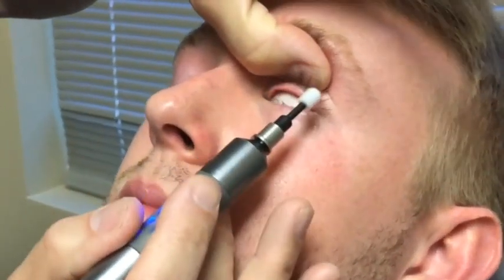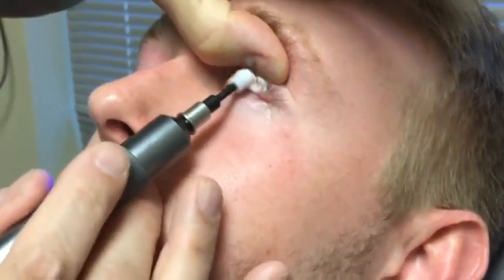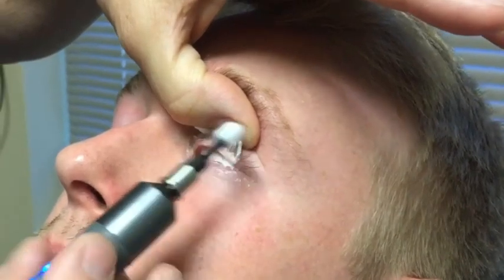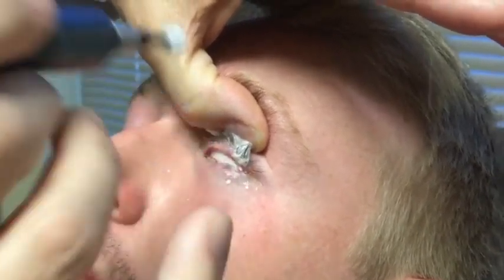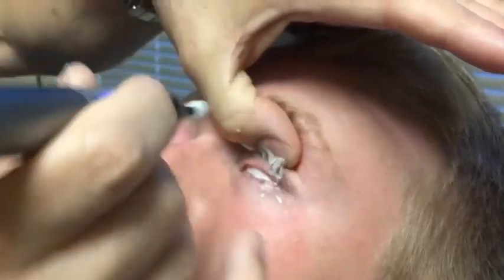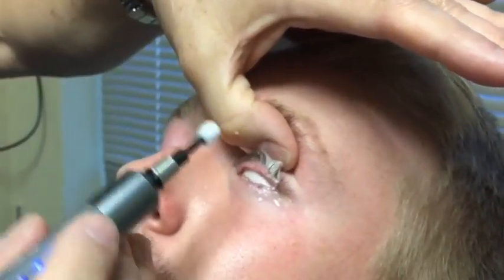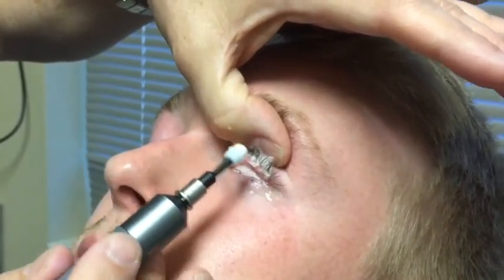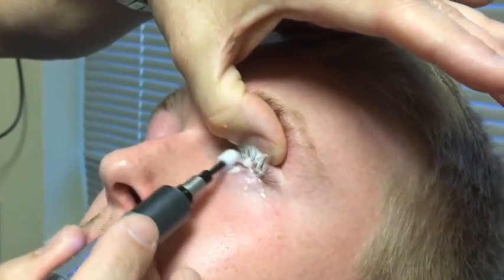I'm going to come in flush again. And you want the face of the sponge on the lid margin, not the tip. That's why you want to keep the back down. If you bring the back up and try to treat like this or treat like this, you're free-handed like this, you're not stable, you're not comfortable. And like this, you're treating with just the tip. You get better cleaning, get the face of the sponge on the lid margin.